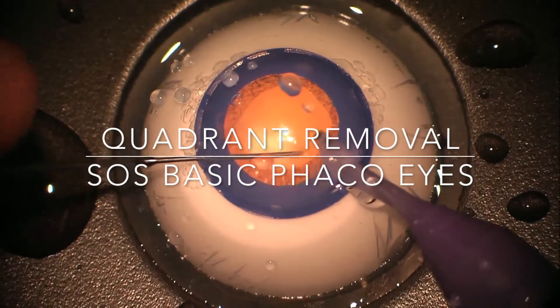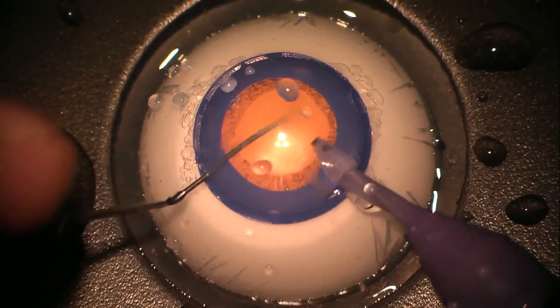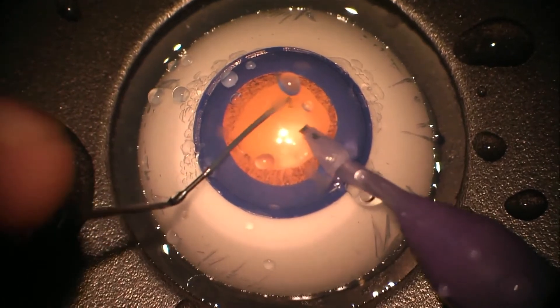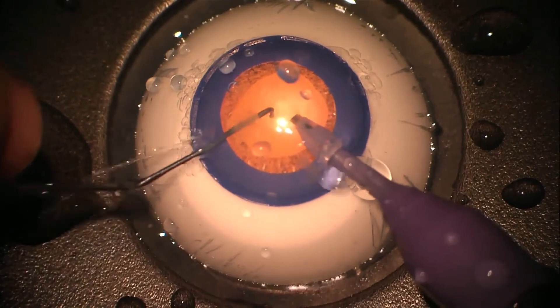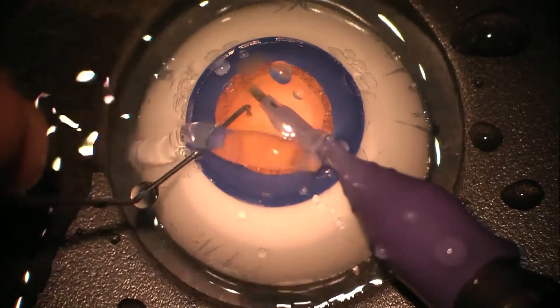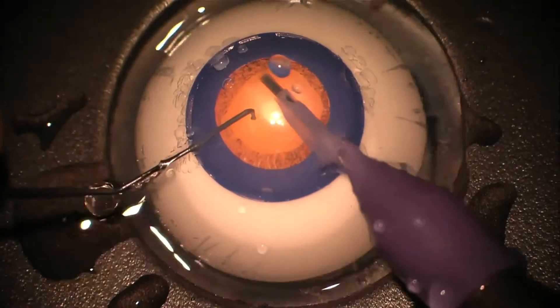In this video we're illustrating how we use an SOS basic cataract eye to practice segment removal and once again consolidating the skills the trainees would have learnt with the IC modules.